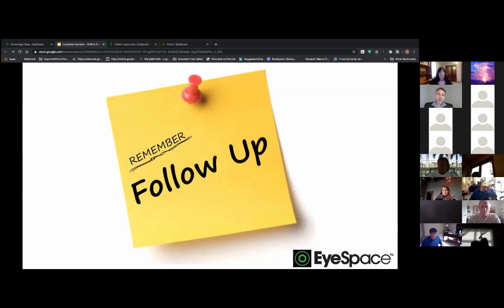And you're not going to change a fit on day one. You're not going to bring the patient in on day one and decide, oh, this lens is not working, let's make some modifications to the lens. That's going to only happen 2, 3, or 4 weeks down the line. So day one for me is rather when the patient comes in, I have a quick chat to them. How did it go? What was your experience? Were there any issues or concerns we need to talk about? So it's more about the patient experience for me on day one.